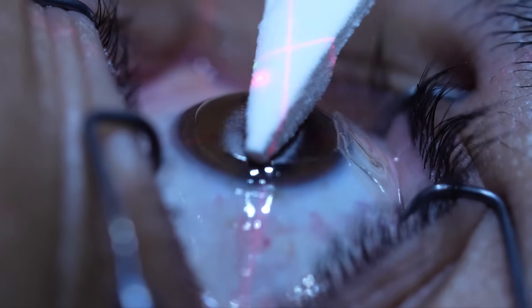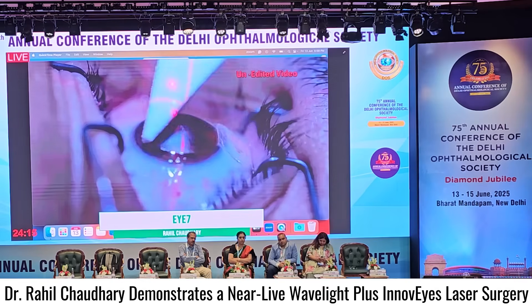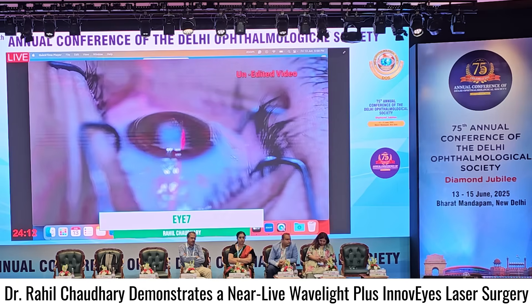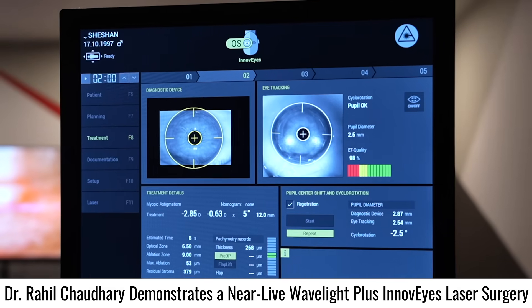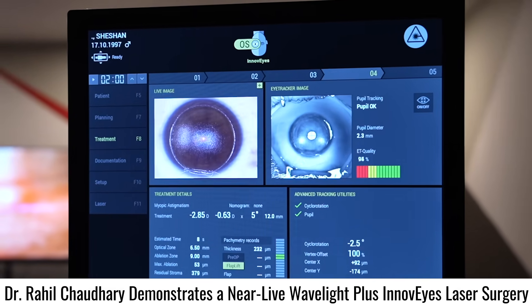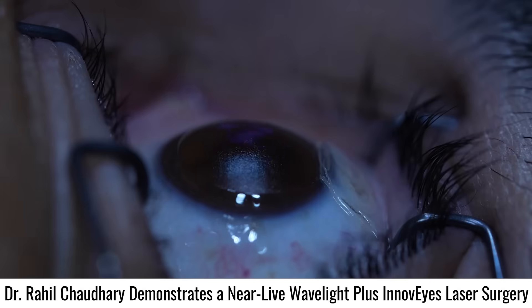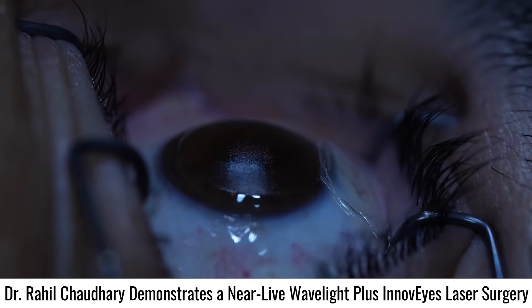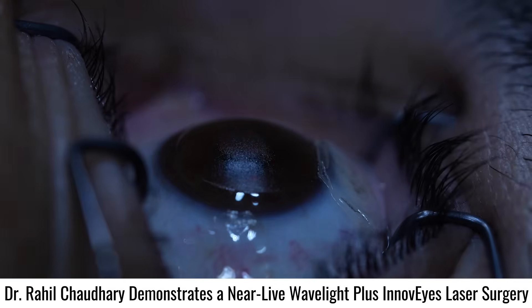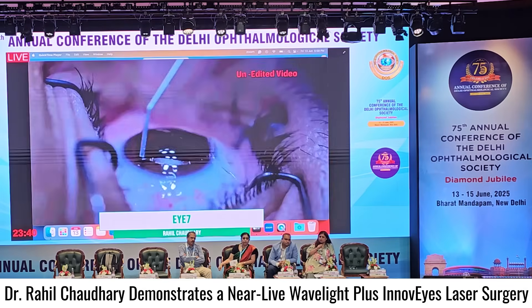Just cleaning the stromal bed — we want to make sure that there are no residual secretions or water hydration on the bed. We are ready to fire. Taking cyclotorsion 2.5 degrees. The laser is ready and we start. You can see here that the laser is falling onto the stromal bed, doing the ablation. The total maximum ablation we are doing is 53 microns for this patient. The ablation is nice and centered with 100% visual axis offset.